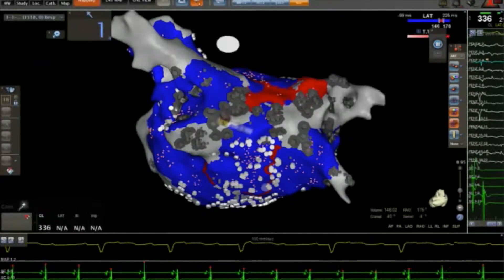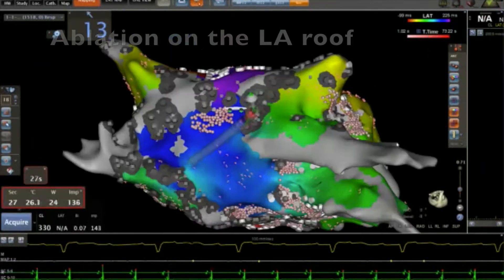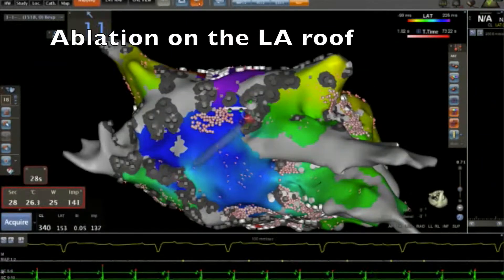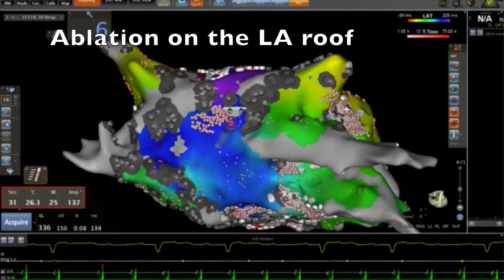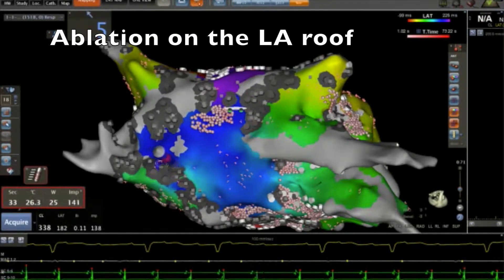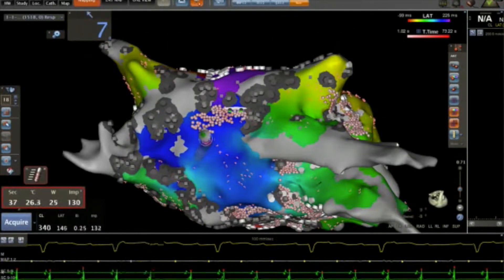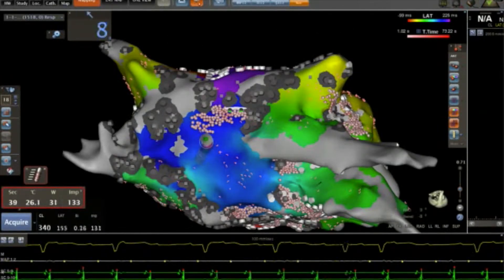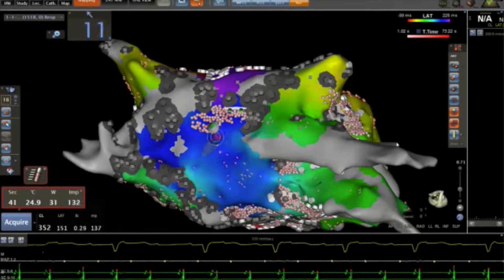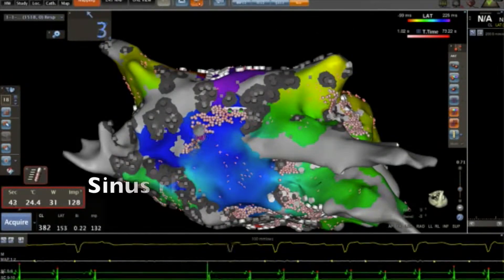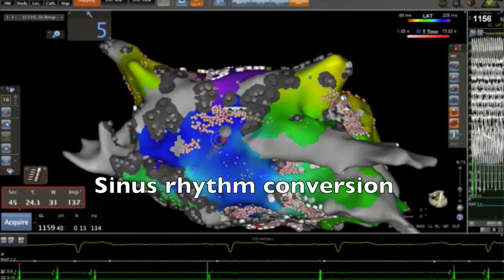In order to stop this flutter, we created a line on the LA roof. This line terminated the atrial tachycardia and we restored sinus rhythm again.